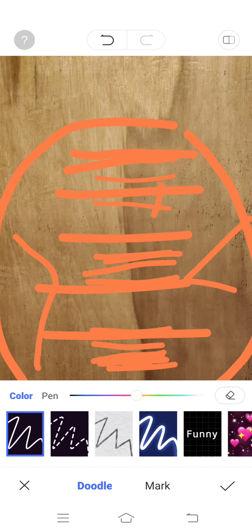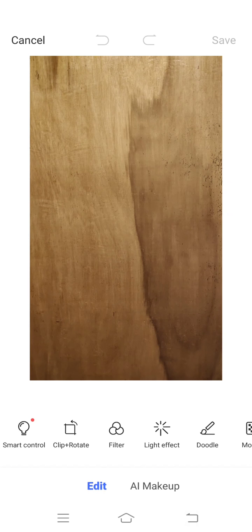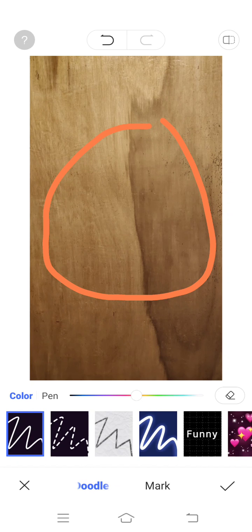You know, you ask people around you, people that you know that use progressive lenses, especially the first time wearers, they will always say that they experience a lot of discomfort at first. You know, you need some type of adjustment period when you're using progressive lenses. Usually it's about 2 weeks. Okay, 2 weeks.